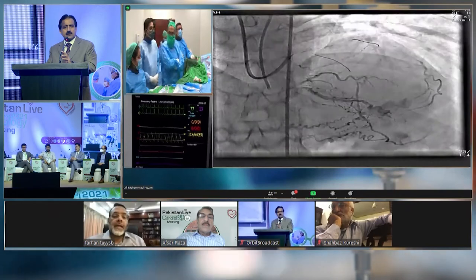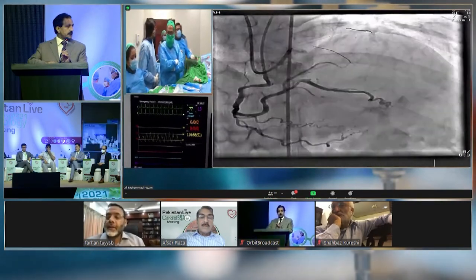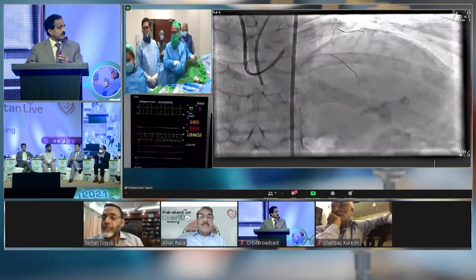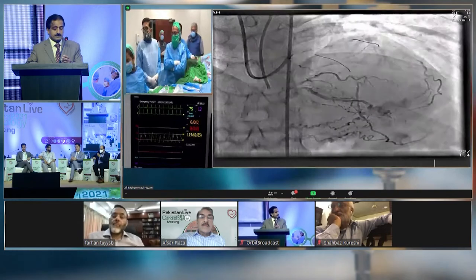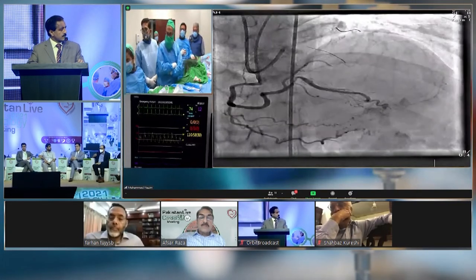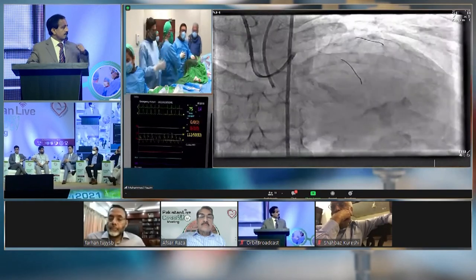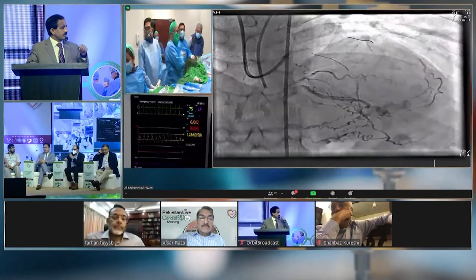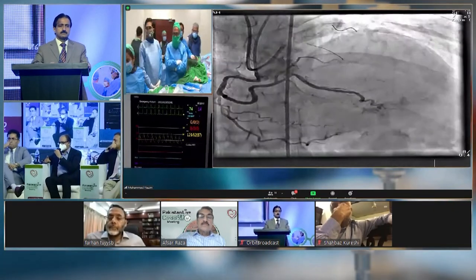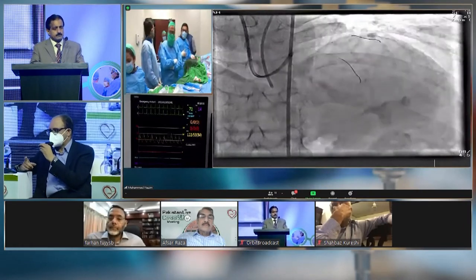Farhan, let's take some comments from the panelists and see what they would do or what they think. Nasir, if you were doing the case, what would you have done? So what we are dealing with is a severe three-vessel coronary artery disease. They have fixed the right, and we are left with three bifurcations. I can see a collateral going to the circumflex from the right as well as to the LAD, and there is a left main disease.